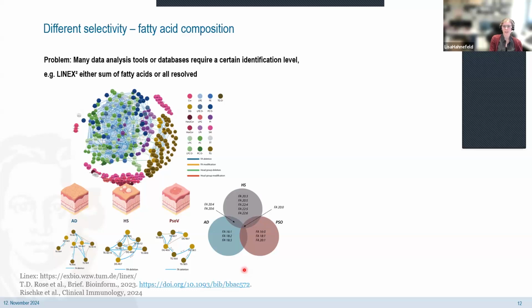But interestingly, the triglycerides, which were interesting from a different statistical approach, were not covered with Lipidyzer, so they were not detected. There was nothing interesting about them, and it was most likely that the software couldn't handle that there were several isomers now aggregated together. So unfortunately, I don't have a good solution for you.